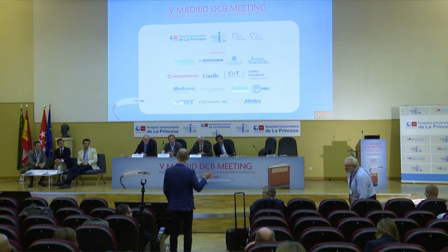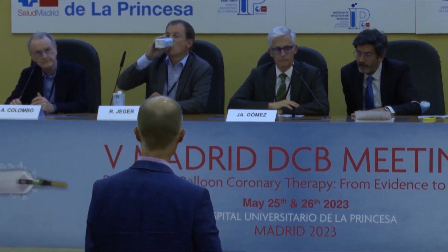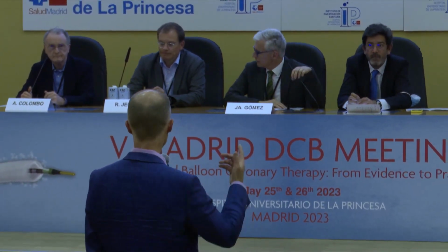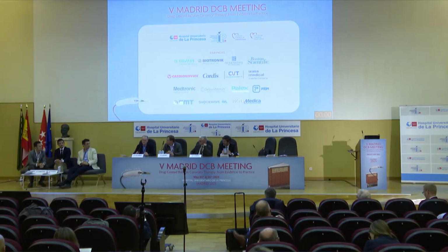Last comment. Following on from that, I think one of the issues, and the reason why we've ended up doing what we've done, is the more you look at the data, the more you realise there is no data. There is nothing telling you that putting stents in everybody saves lives. All that stents ever were supposed to do, as you well know, was get people safely out of the cath lab. And from then they've just been adopted into practice. But actually in those original studies, the acute vessel closure rate was higher in the stent arm of Benestent and STRESS as compared to balloon angioplasty. And that was before dual antiplatelet therapy. And we all know dual antiplatelet therapy made all of our angioplasty safer, but actually it was stents that got patients out of the lab, and that was what they were designed for. The rest of it is just about reducing restenosis, and we know how to reduce restenosis. It's good lesion prep and a DCB. But that's what the standard practice is. It arrived there not following the right path, but it got there. So now we are there.